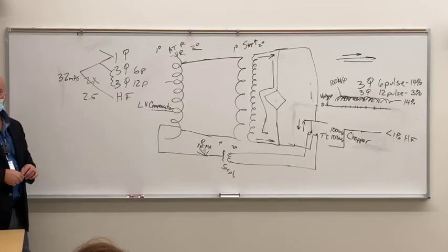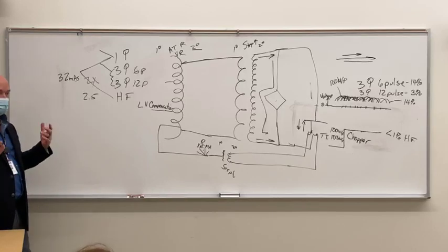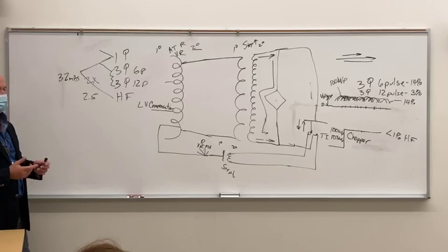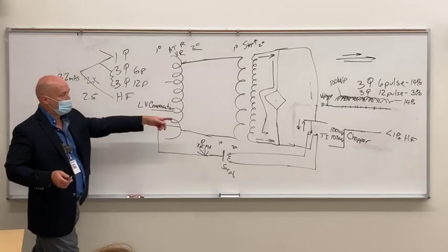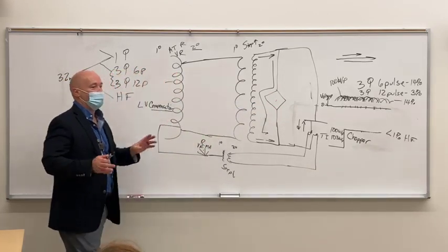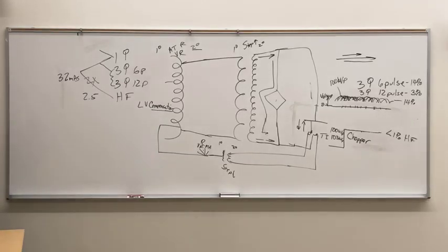And the single-phase room was on phototiming too, so you had to know your techniques and you had to be able to make the adjustments. The hospital itself was a mess. We had a three-phase room that I think had some burnt-out rectifiers because the techniques didn't work anywhere on the planet like what they did in that particular room, let alone in the x-ray department.